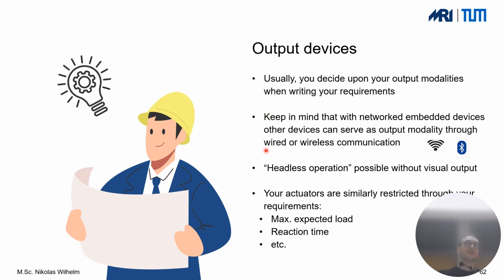And then for the classical way, until like 3-4 years ago, what was very classic was that you had external monitors for each of your embedded systems. Of course, they're heavy, and they need lots of signals to be connected to be able to display something useful. So one recommendation I would highlight is that nowadays it's really nice to focus on communicating the information of this microcontroller via Bluetooth or wireless communication to an external device.